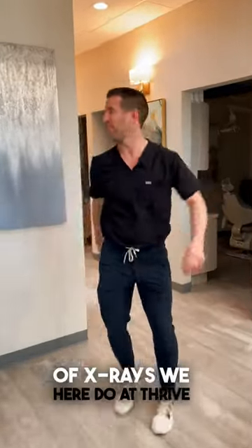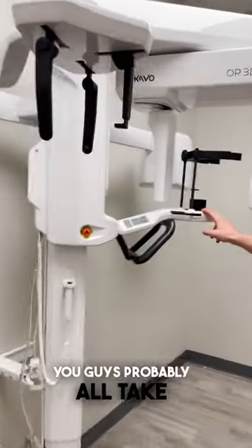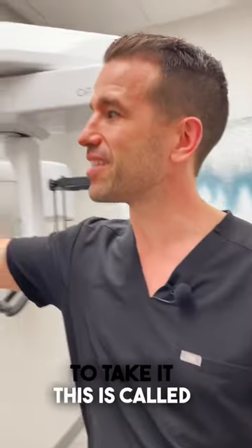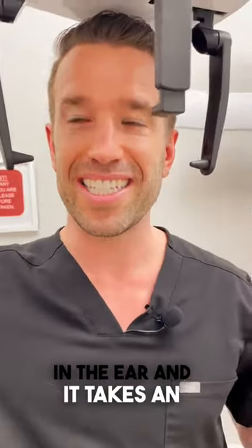Want to see the two different types of x-rays we do at Thrive Dental? We've got two special types. This is a pan-ceph machine. This is something you've probably all taken — if you're getting wisdom teeth out or getting braces, you're going to take it. This is called a cephalometric x-ray machine. We come in here, put these little doohickeys in the ear, and it takes an x-ray from the side.